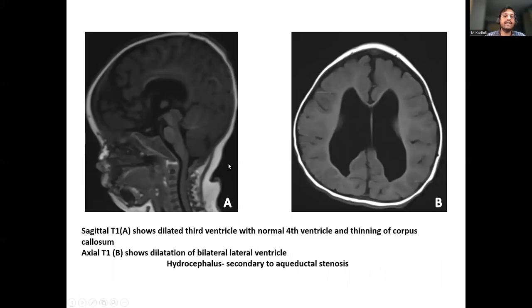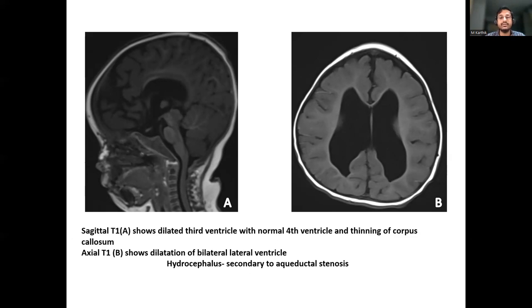A sagittal T1-weighted image shows a dilated third ventricle with a normal-appearing fourth ventricle and thinning of the corpus callosum. The axial T1 image shows dilatation of the bilateral lateral ventricles; the diagnosis was hydrocephalus secondary to aqueductal stenosis.